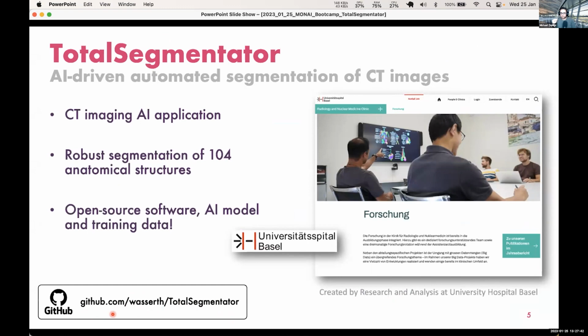Let's see, is there a way to choose the required segmentations of TotalSegmentator? This one says, is there a way to choose the required segmentations on TotalSegmentator? So TotalSegmentator by default will just attempt to provide all 104 anatomical structures, but say your field of view is focused on the chest region, and obviously the head's not in that region, so therefore it can't provide the segmentation. It will just provide effectively an empty NIfTI file.